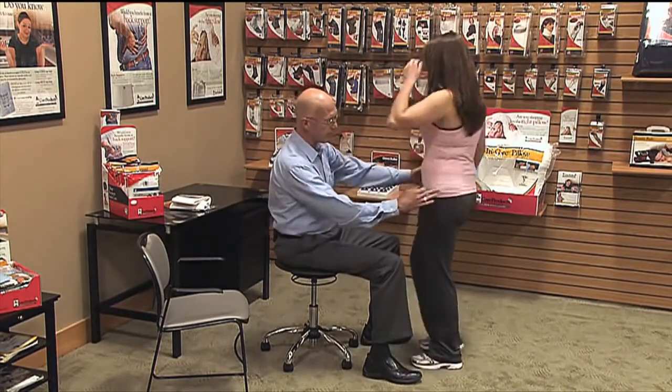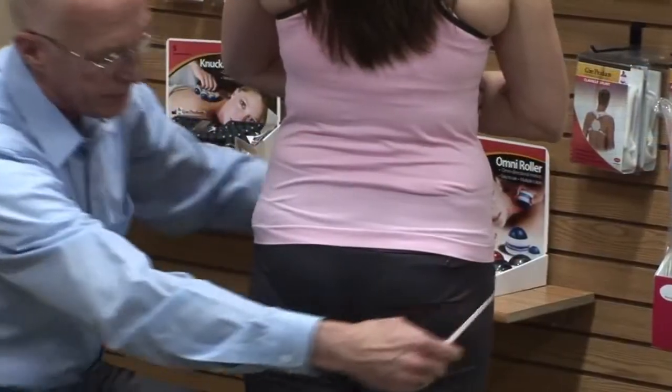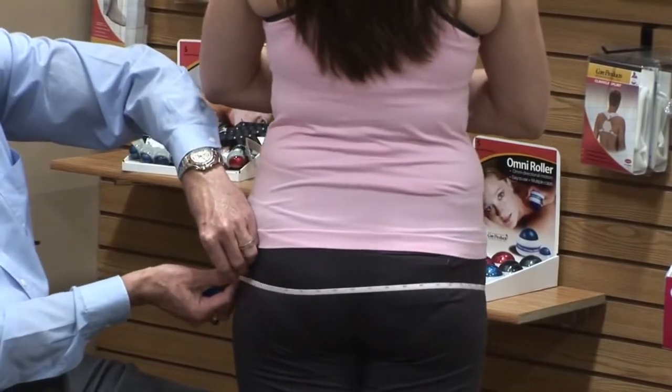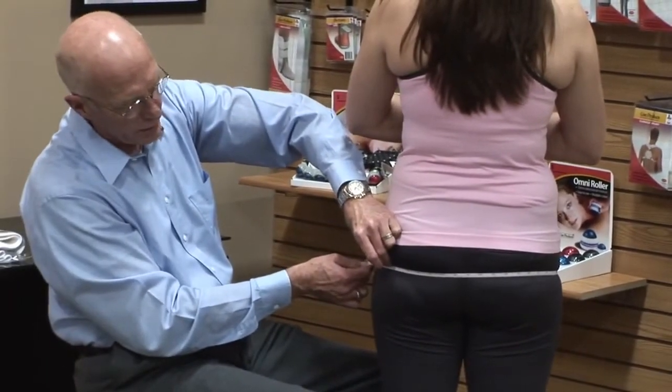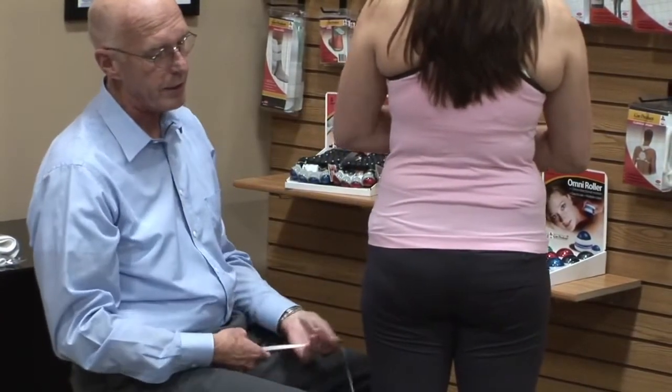This is typically helpful for someone with an achy back. We're going to take measurements — this is fit on a snug hip measurement. I want to see the patient from the side and take that measurement at the fullest part of the buttocks. You really want to crank on this one and make it a very snug hip measurement, because that's how the products are sized.